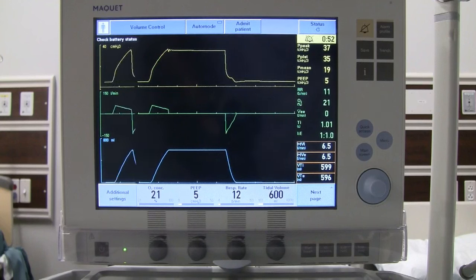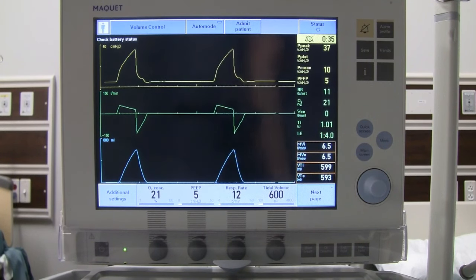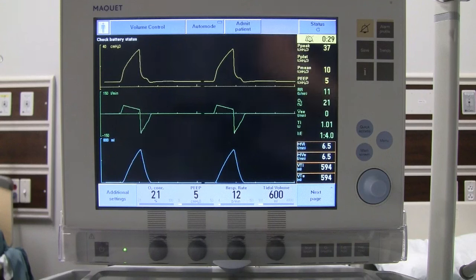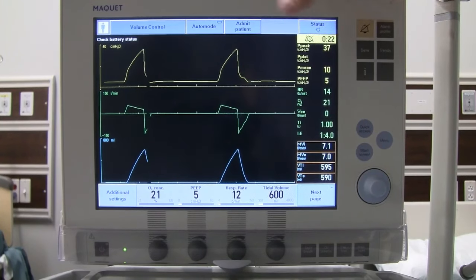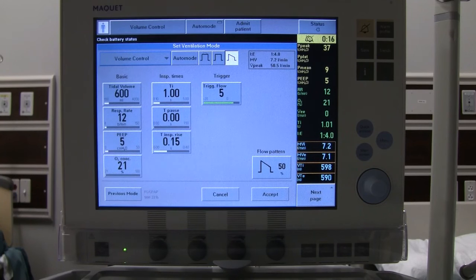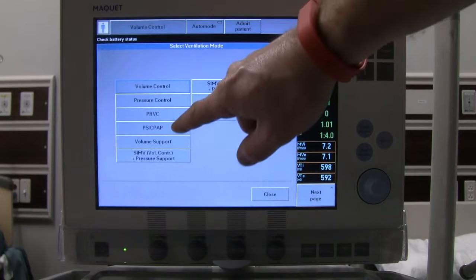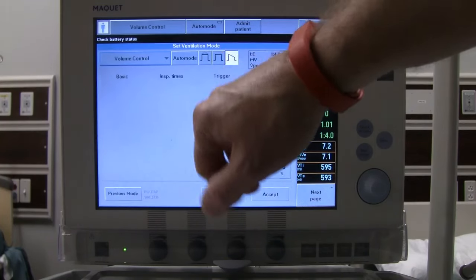A plateau of 35 is generally considered dangerous — we don't want it that high. Our first thought in most facilities is to switch to pressure control to better manage pressure and keep the patient safe. Since we've already obtained the plateau pressure of 35, that gives us a starting point when we go in and set up pressure control. Go back into modes and select pressure control.